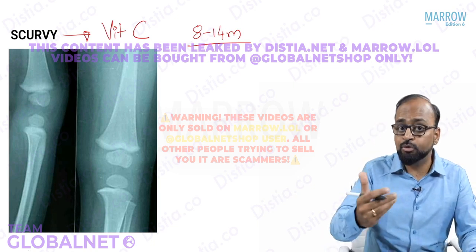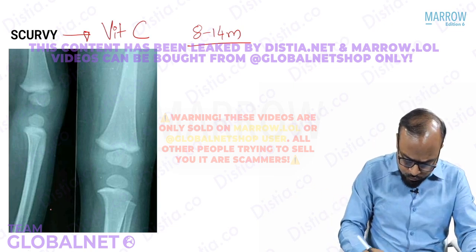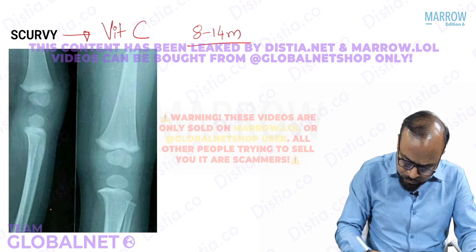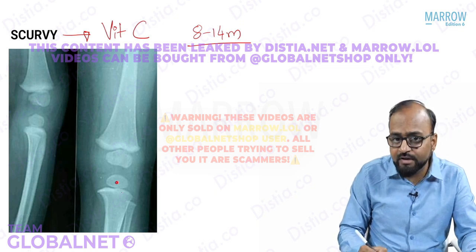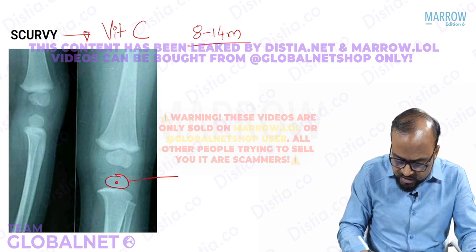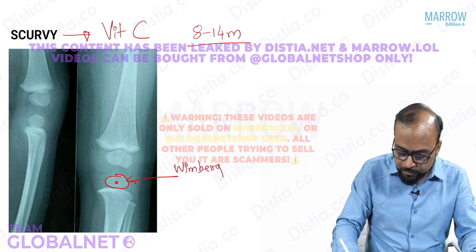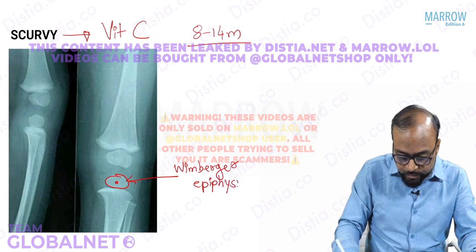Now we will come to the pathophysiology of scurvy in short. Let us quickly focus on the imaging findings here. So what we see basically here is that the central portion of the epiphysis becomes lucent and there is a sclerotic white rim around it. This epiphysis is given a name. This is called the Wimberger epiphysis.